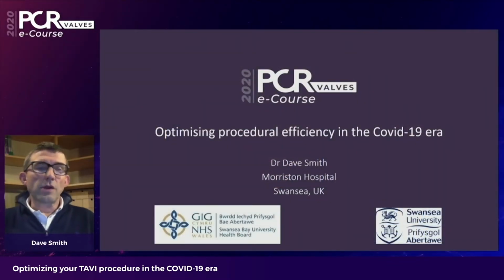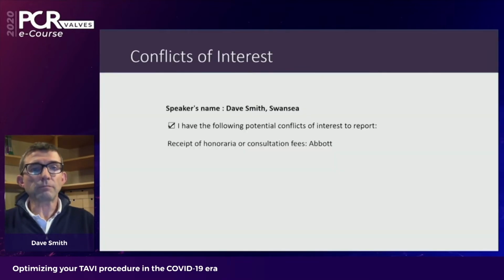Okay, thanks, Lars. So my name is Dr. Dave Smith. I'm an interventional cardiologist at Morriston Hospital in Swansea in the UK. And I'm going to talk about how we optimize the procedural efficiency of our TAVI procedures during the COVID-19 era.